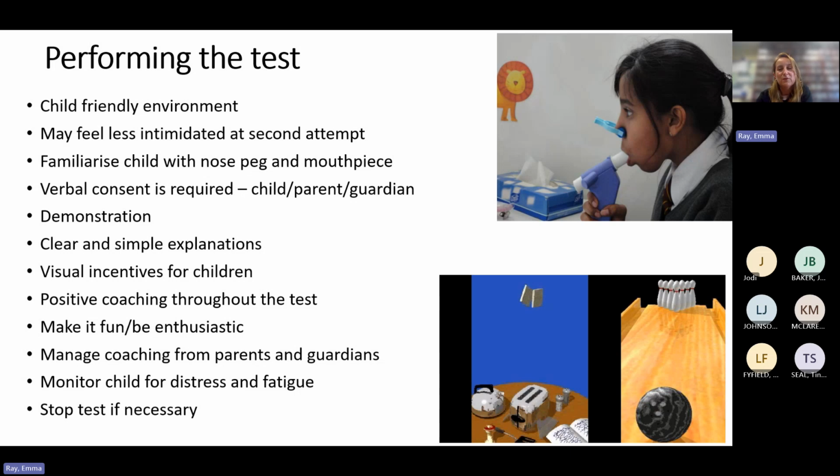Sometimes it can be useful. Sometimes actually children will just do it with the coaching. So it can be useful and it cannot be useful. So again, positive coaching throughout. Just make it as fun as you can. Be enthusiastic. Unfortunately, sometimes parents or their guardians can interject and start coaching the child, which can be a bit difficult at times. So managing that can be tricky.